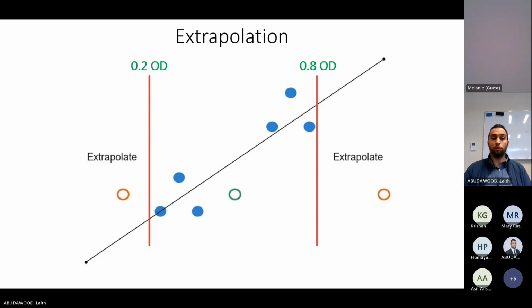Even if you get an optical density outside of the calibration curve, the analyzer can still give you a concentration based on extrapolation. However, if you use von Willebrand ristocetin, that's a third order polynomial, let's say. If you exceed your calibration limits, the analyzer will tell you, I don't know. MMin or MMax. I'll explain that in a second.